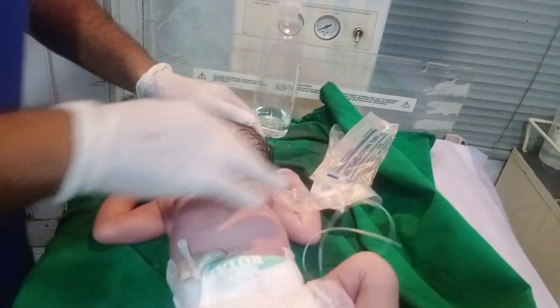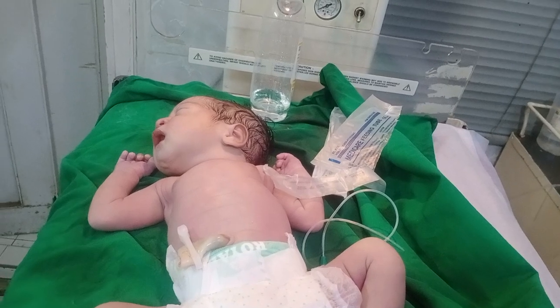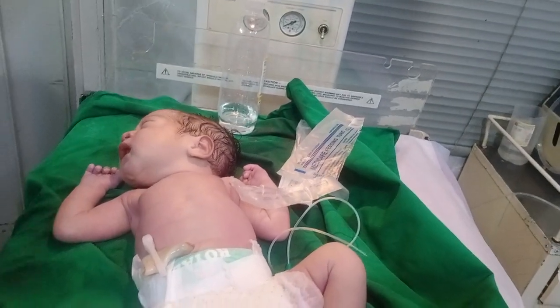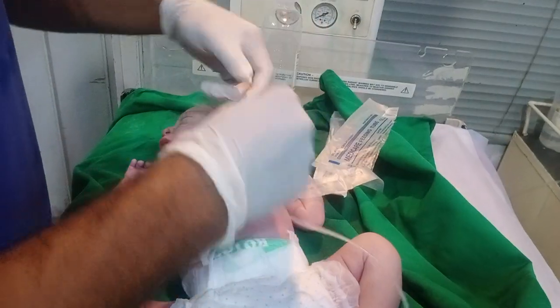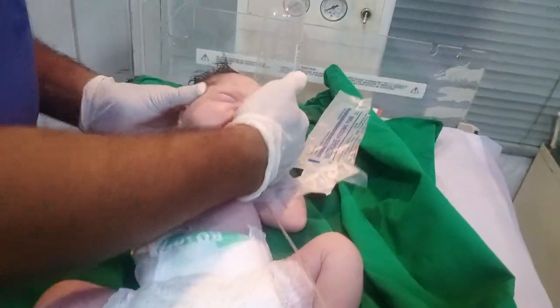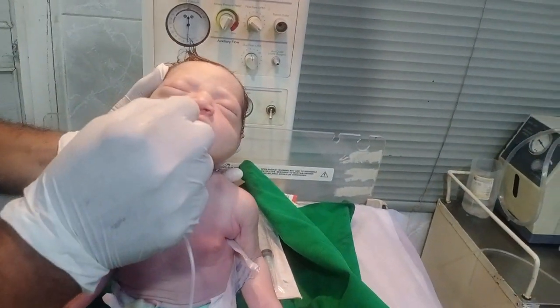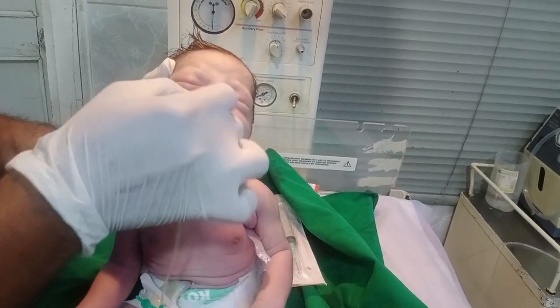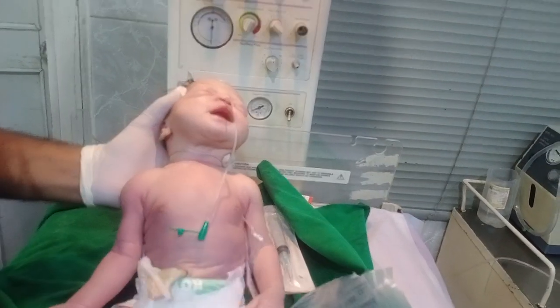Hello guys, welcome to my video. A female baby has presented with meconium aspiration syndrome. Meconium is a toxic fluid — when the baby inhales it during birth, suction becomes mandatory.